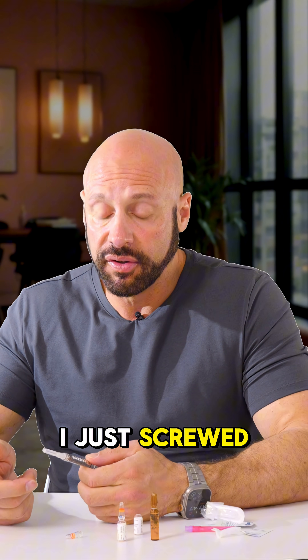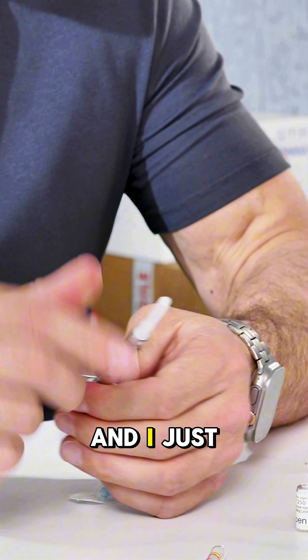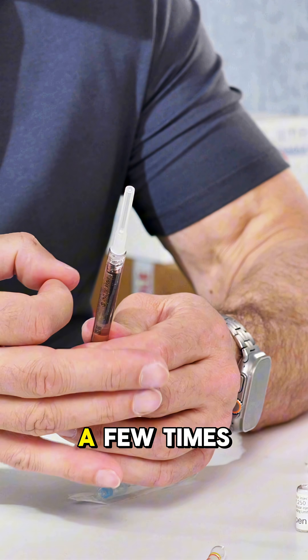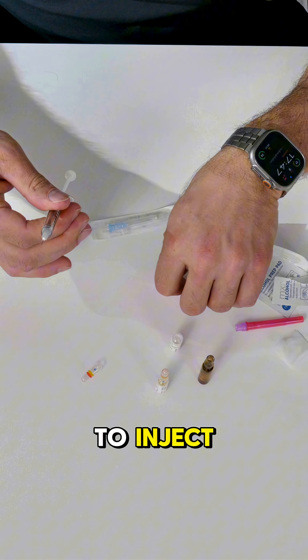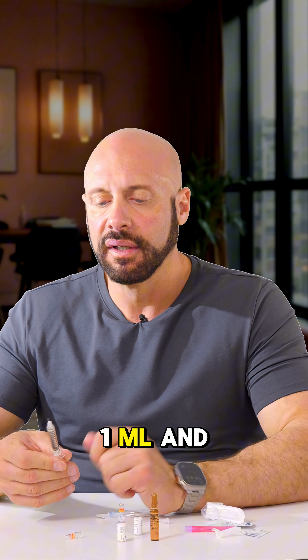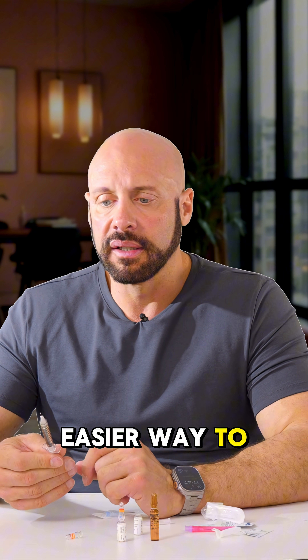There's a little lock, so I just screw that on. There's a little bubble of air — I tap it a few times and push from the bottom of the plunger to make sure there are no bubbles. If I were ready to inject, I'd make sure all the bubbles are out. Here I am right at exactly one mill and ready to inject.